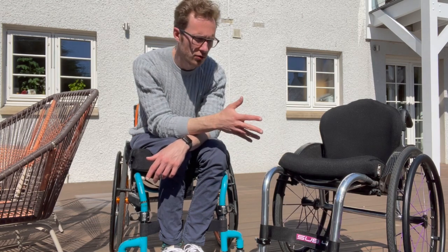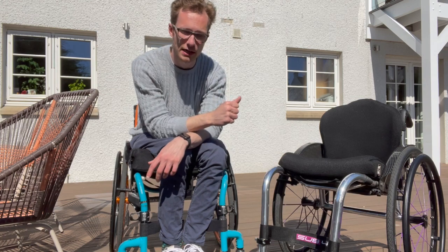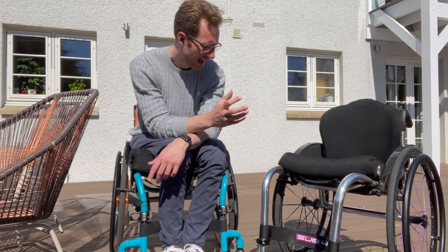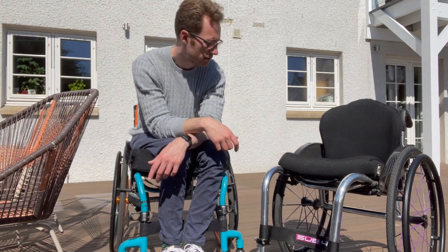I should start with a caveat that I have only had this for three months or so, but in that time I've used it pretty much every day, sometimes 12 plus hours a day, and I've got a pretty good feel for how it is and what I like and don't like about it.